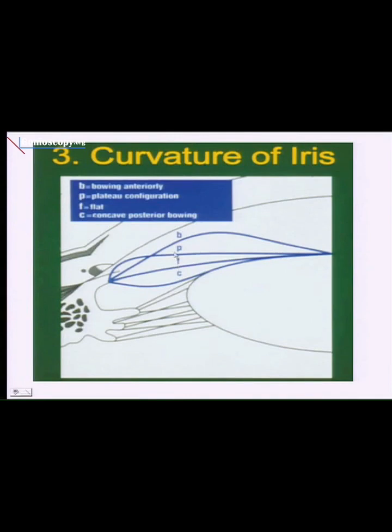Now, this was not my contribution. It was originally described by a great gonioscopist from South America, Busaka. And he described this many years ago in his wonderful atlas of gonioscopy. It's an interesting phenomenon, why so many things are described and ignored. This is a really essential part of describing the anterior chamber angle. Why was it that nobody paid any attention whatsoever to Busaka's important contribution? That's a subject for another lecture.